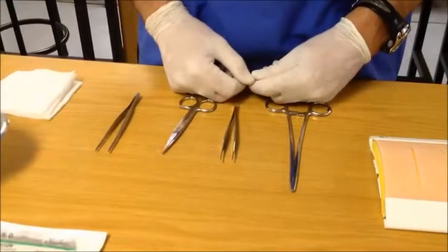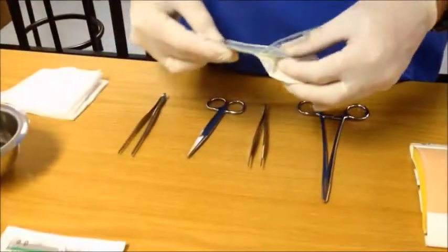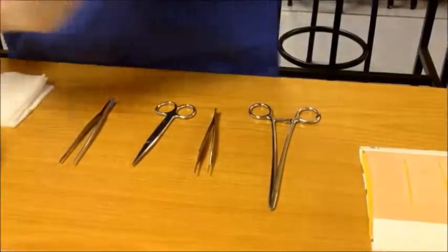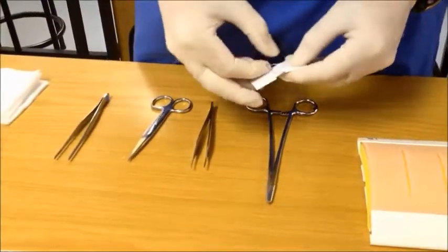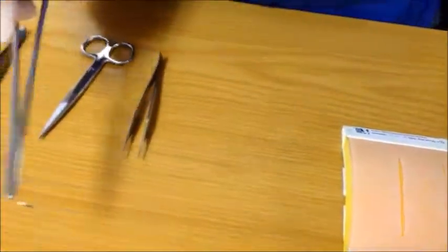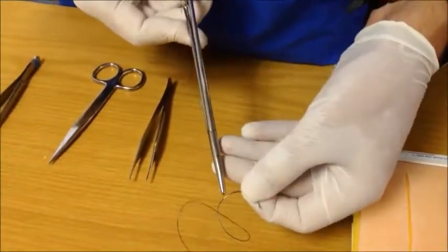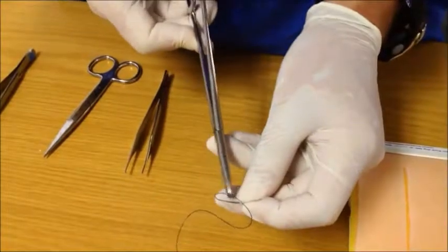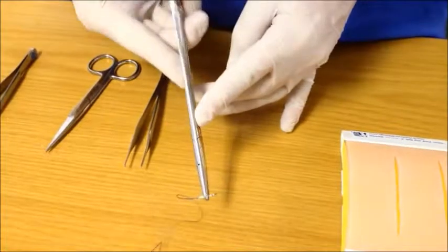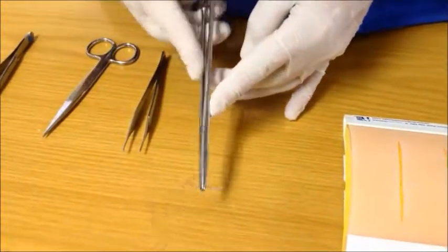Once the skin has been prepared, proceed to suturing. In this case, we are going to use a nylon monofilament suture. Open your suture, reveal the needle and grab the needle with your needle holder. Hold the needle about a third to a quarter from the back of the needle on the flat surface with the tip of the needle holder. This allows for an easy rotating motion of the wrist to take the needle through the skin.